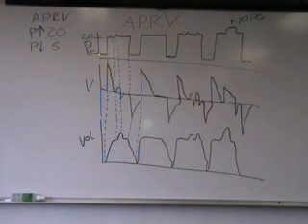So what happens is during the P high time, the person will go from P low to P high. When that occurs, we'll see a flow rate that decelerates like any pressure-controlled breath. Volume will be delivered while that pressure gradient's established. When we're on the P high time, the person can breathe spontaneously. Here they inhale and they exhale, and therefore I see a flow pattern that's sinusoidal, because this is a spontaneous breath.